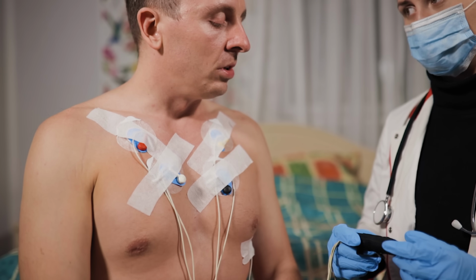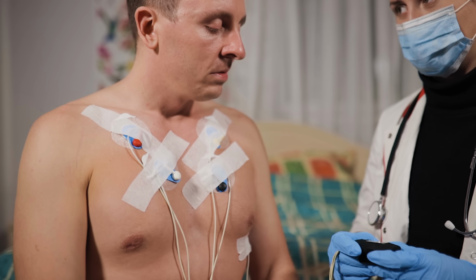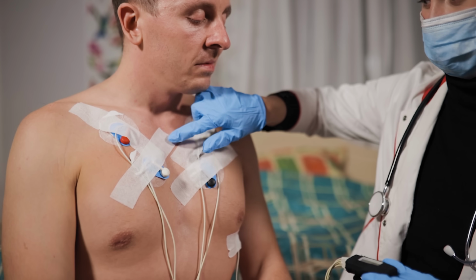Everyone has about 100,000 heartbeats a day, and we count every single one of them. And we're looking for, are you in a normal rhythm? Are there times when you're in a fast rhythm or a slow rhythm? Are there times when your heart paused? Did it just not do anything for 3 seconds, 5 seconds? And we're correlating all of that with a diary. So we ask patients to keep a really specific diary. If, for instance, at 7:16 in the morning, you had a racing heart, be very specific. We're going to go to 7:16 on the monitor.